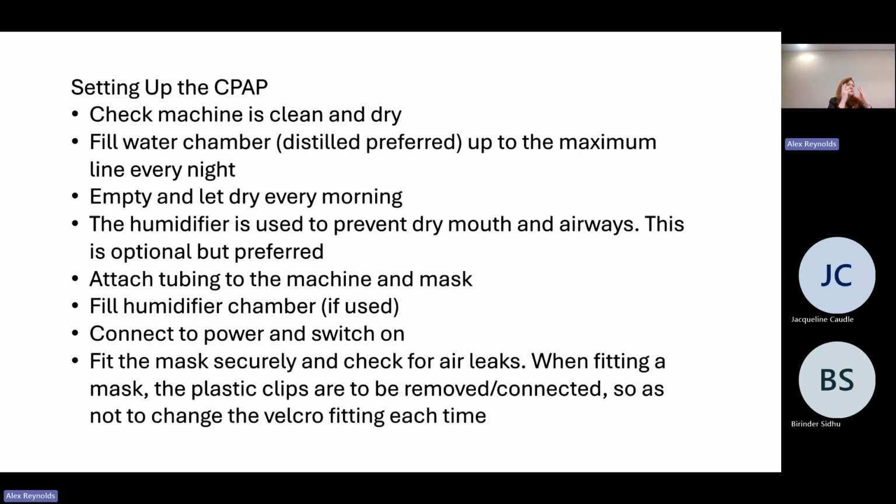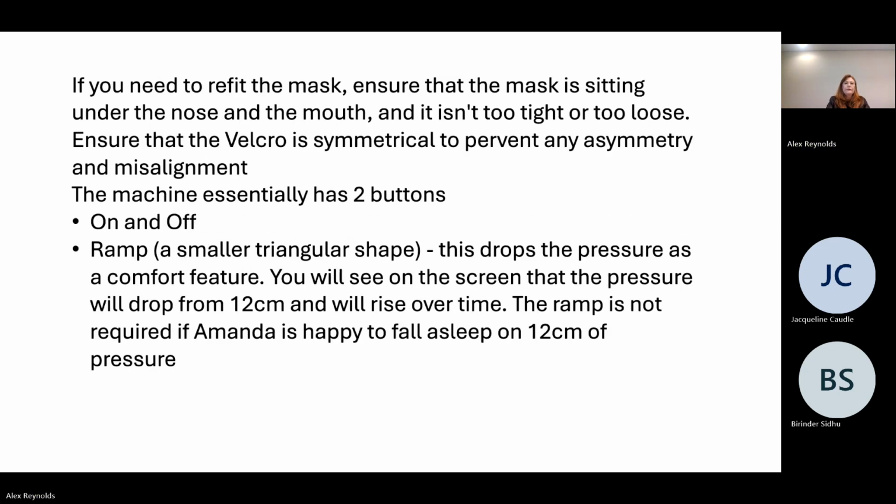So basically, once the mask is fit for the customer, we don't change it much at all. There's no need. Okay. If you need to refit the mask, ensure that the mask is sitting under the nose and mouth and that it isn't too tight or too loose. Make sure the Velcro is symmetrical to prevent any asymmetry or misalignment.